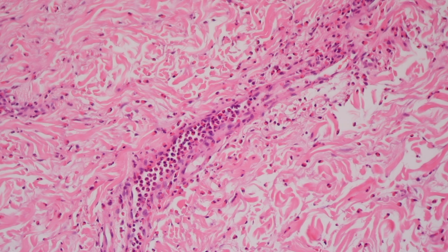But when we see lots of eosinophils, we can think of drug-associated LCV, and we also can think of Churg-Strauss syndrome. So Churg-Strauss, or allergic granulomatosis, is the other name for it, I believe, is usually going to give you a leukocytoclastic vasculitis, and often there are numerous eosinophils, and sometimes those eosinophils are so numerous that they break down and make these red pools of eosinophilic granular debris that make granulomatous type structures. So they look kind of like granulomas loaded with eosinophil debris. And they're called red granulomas is one name that's sometimes given to them.